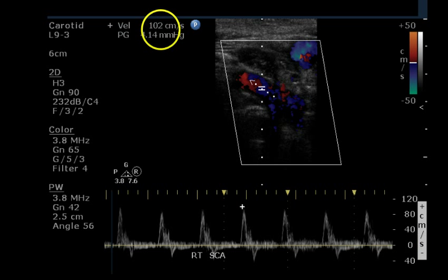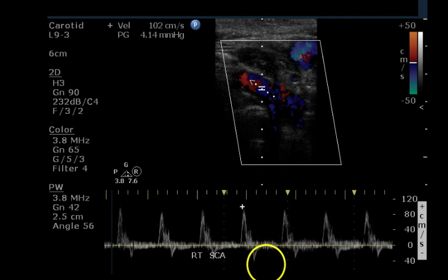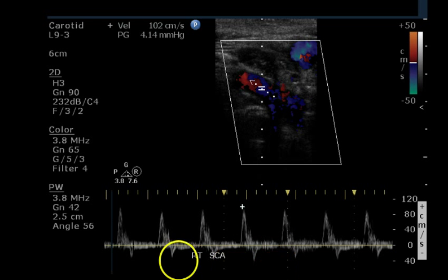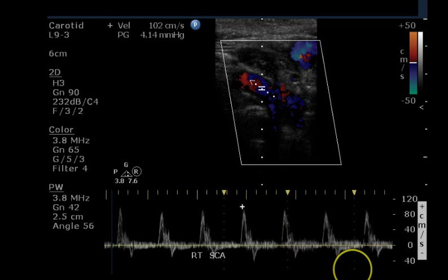We have a peak systolic velocity of 102 centimeters per second. There's clearly reverse flow. We can't tell from this image whether or not there is a third phase, but this is at least a biphasic waveform. This small amount of what looks like noise along the baseline is probably interference from venous flow.